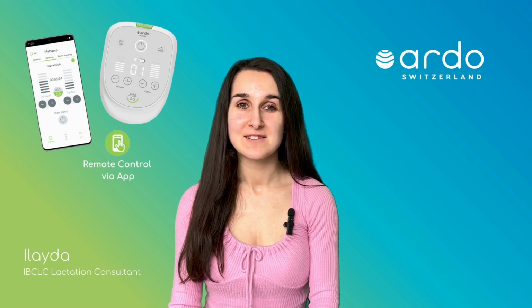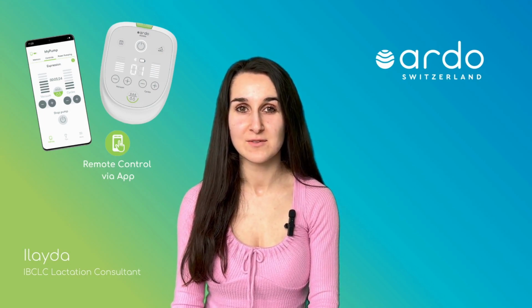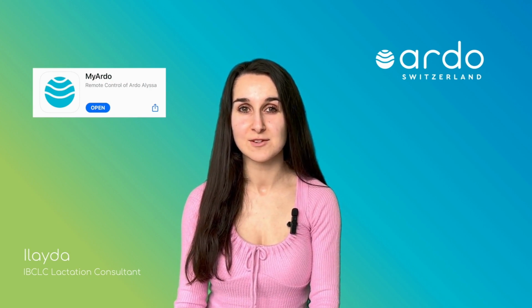Did you know the MyArdo app allows you to comfortably control the Ardo Alyssa Breastpump from your smartphone? You can use the MyArdo app on Apple or Android mobiles. To pair your breast pump with the app, first download the MyArdo app. You need to have an operating system of 13 Plus for Apple or 9 Plus for Android. Make sure you read the instructions for the breast pump before you start.